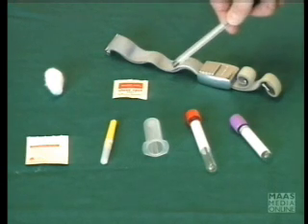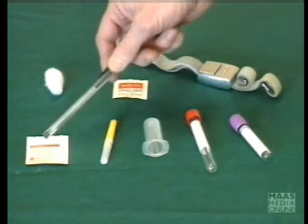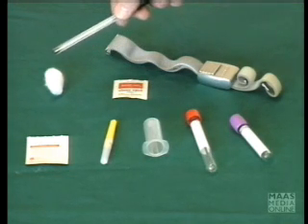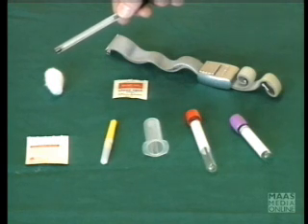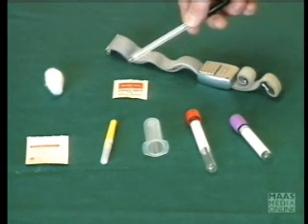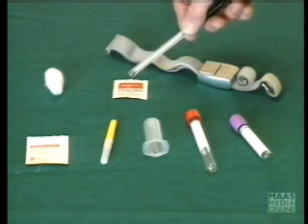You're going to need a tourniquet. It is usual to swab the patient's arm down with spirit. And at the end of the procedure, you're going to need a cotton wool ball, which the patient will actually apply pressure to, to make sure they don't leak blood from the venipuncture site. And in some instances, a band-aid will be put on to cover the venipuncture site.